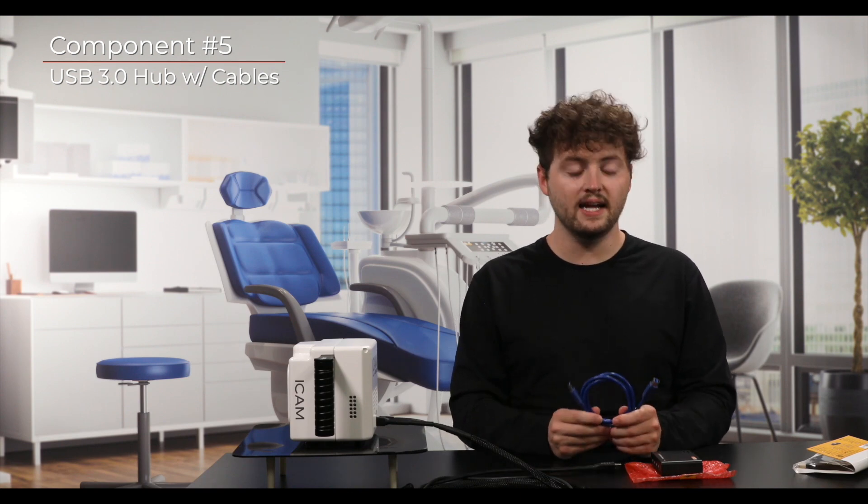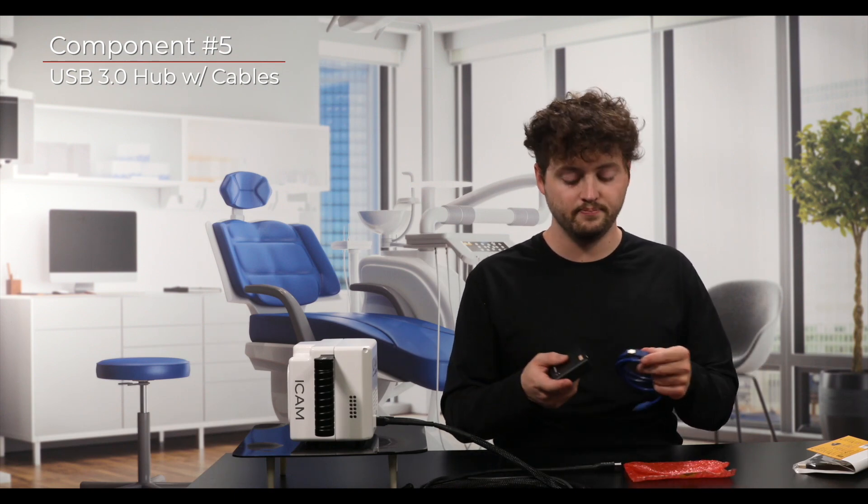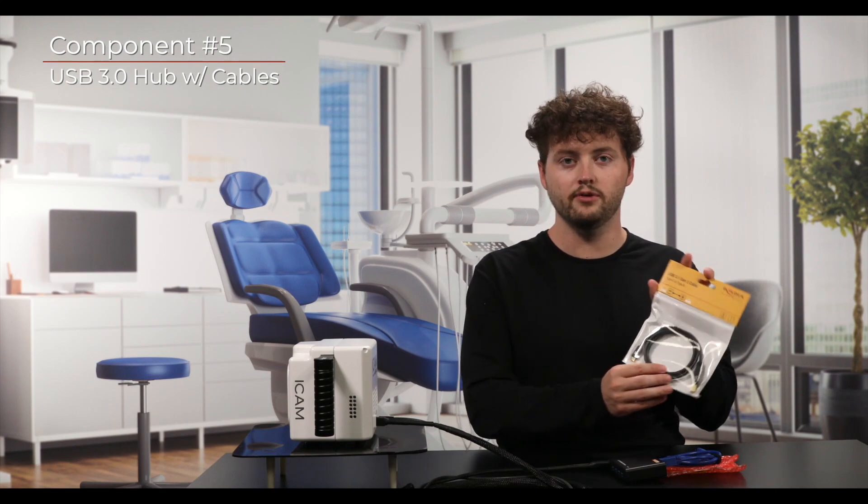The blue USB SuperSpeed cable has an A connector on one end and a B connector on the other. To make the connection, grab the blue USB cable and plug it into your computer using the USB-A male connector. The USB-B male portion of the connector will then be inserted into the USB-B portion of the SuperSpeed hub — the side where there is only one port present. We also have a USB-C to Type-B connector if needed for your computer.